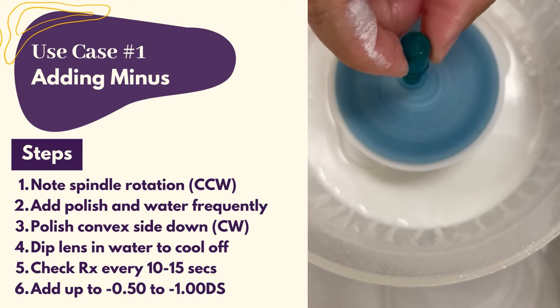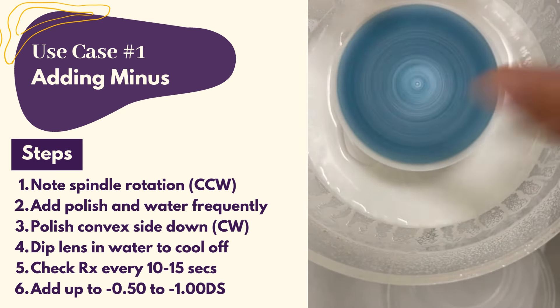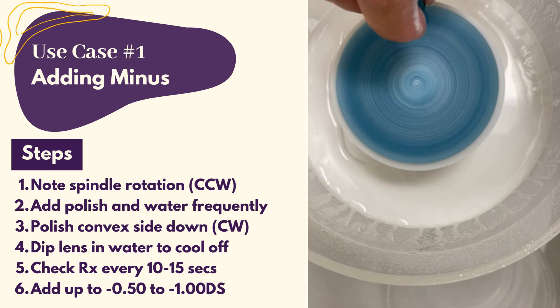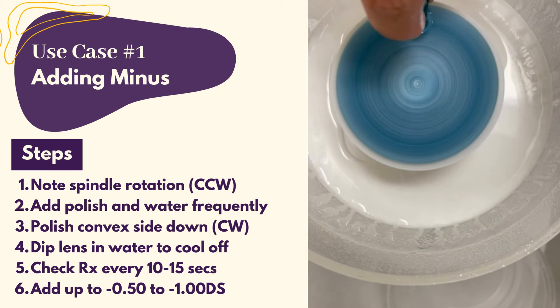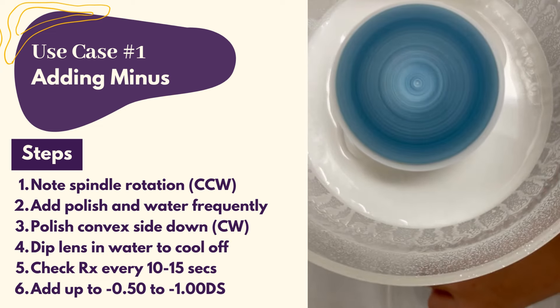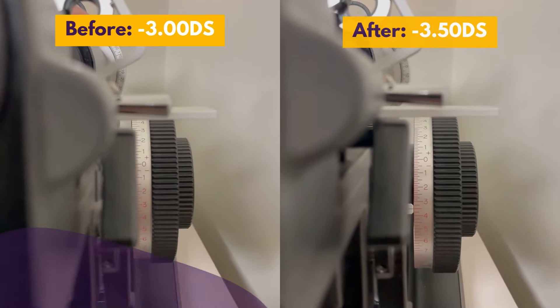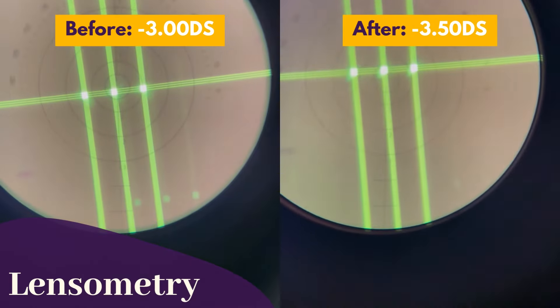Polish the lens convex side down at the 12 or 6 o'clock position of the sponge, where there is the greatest velocity — not the center of the sponge. To prevent warping, you can cool off your lens by dipping it in water. Adding minus can depend on pressure, time, and the type of polish. Check the prescription every 10 to 15 seconds as you gradually flatten the front curvature to add minus. You can add up to a diopter without distorting the optics.